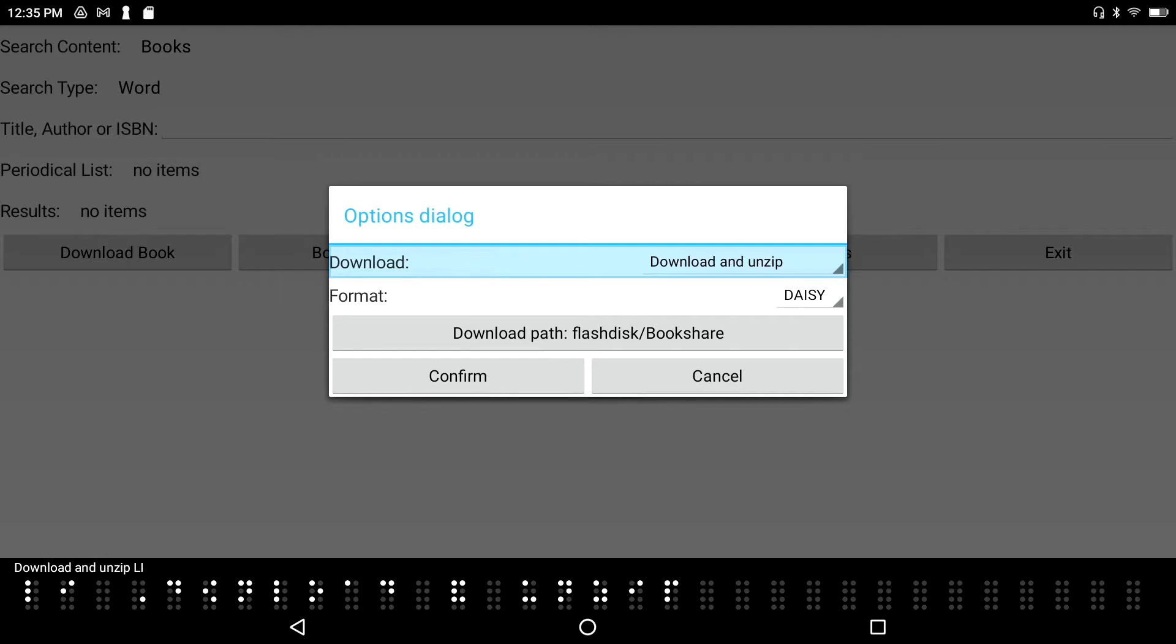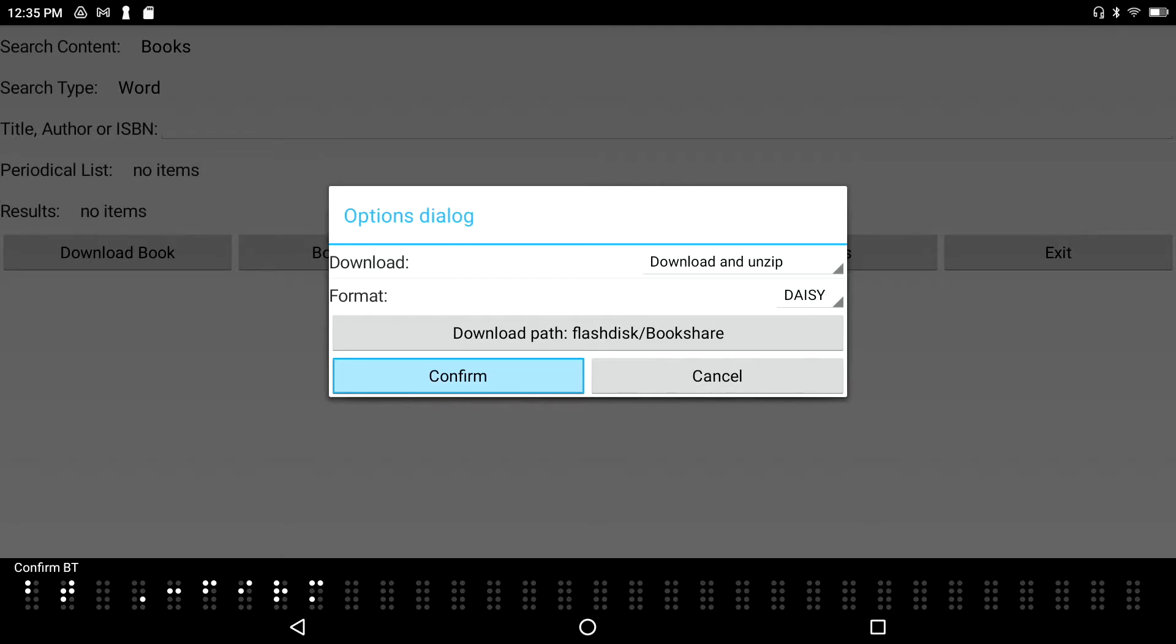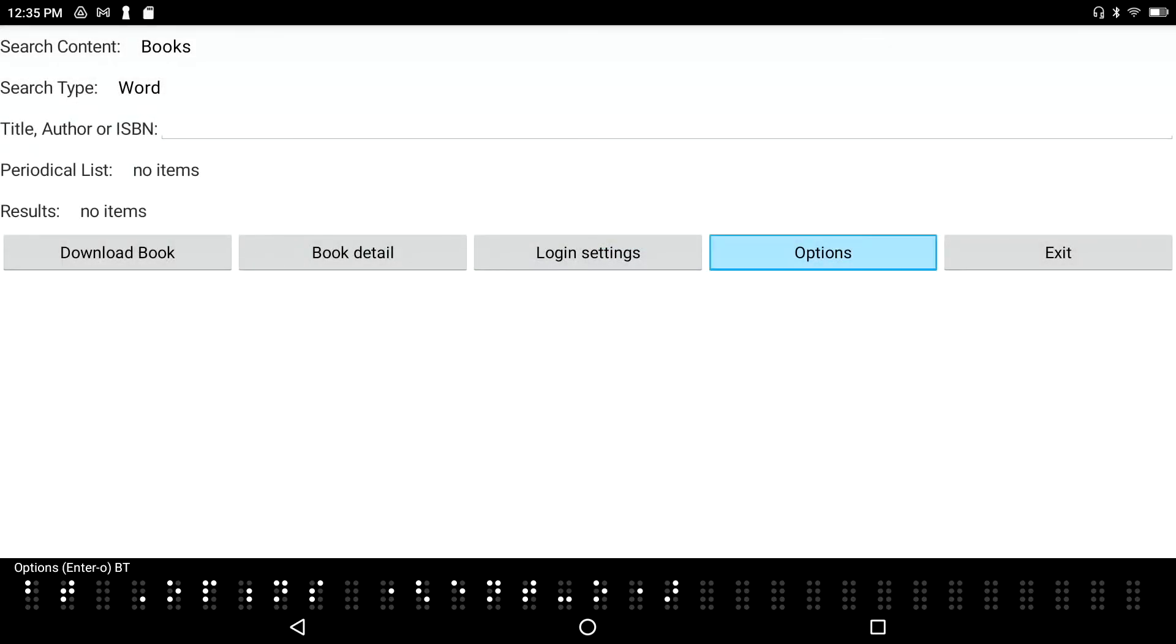Download path: flash disk Bookshare. The default path is the Bookshare folder and I'm going to keep it there. I'll press Confirm. Now I'm going to tab back to the title, author, or ISBN edit box and type in a title. Let's say Stephen King.